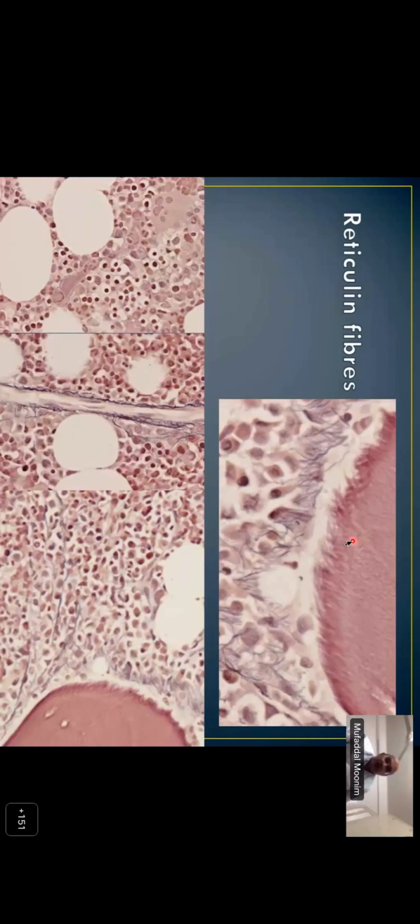And these pictures try and explain how it does that. If you look at the top picture, this slightly light orange brown area is the bone trabeculum. And if you look carefully, you can see all of these fibers which seem to be arising from the endosteal surface of the bone and going in between the hemopoietic cells. Can you see that? Great. And as they get into the marrow, if we look at the bottom middle picture, they wrap themselves around the arteries which course through the bone marrow, providing support. And then if you look at this picture, they start forming the walls of sinusoids.